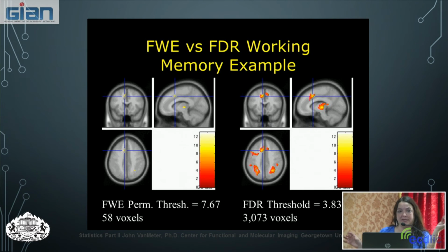So we're making an adjustment and we're thresholding at this particular place where we say after this we won't see any more activity. So if we use this false discovery rate test here, we see that we get more activation. So it's a much less conservative technique, or we are actually letting more activation through by using this false discovery rate correction.